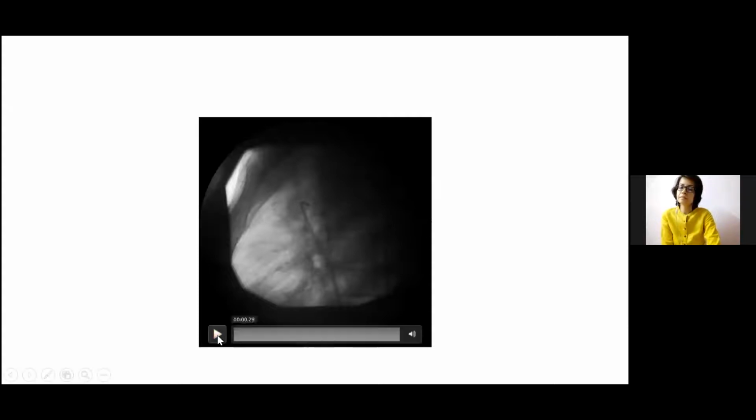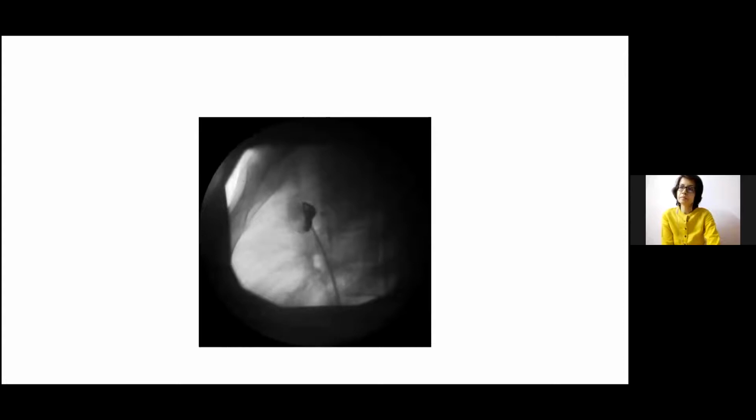So this is the angiogram which we took very, very carefully after we had entered the aneurysm, being extra careful that we do not damage any surrounding structures. You can actually see some filling defects, which are the thrombus sitting inside. So there was some danger of the thrombus getting dislodged as well. Hence, we were extremely careful, and this was actually Debasree handling the catheter while I was injecting.